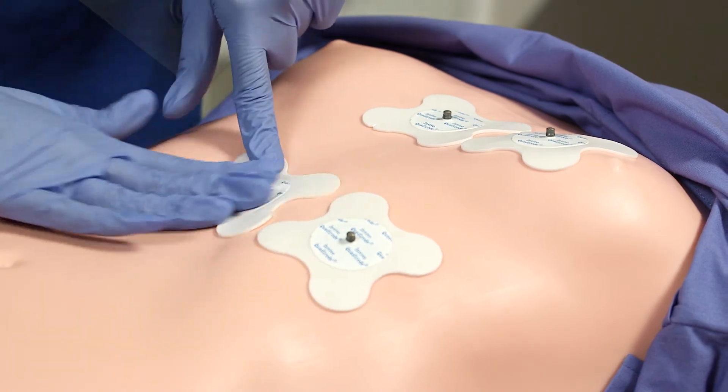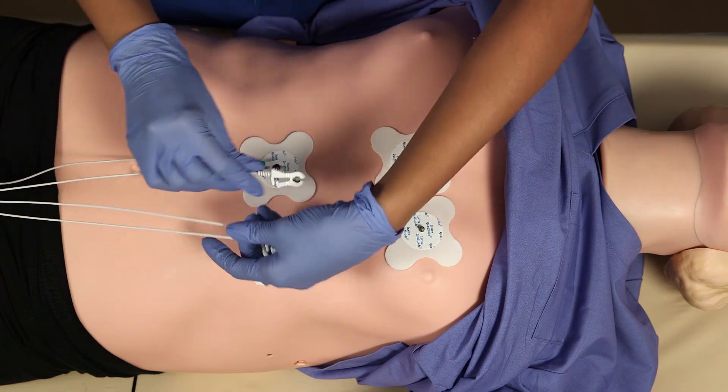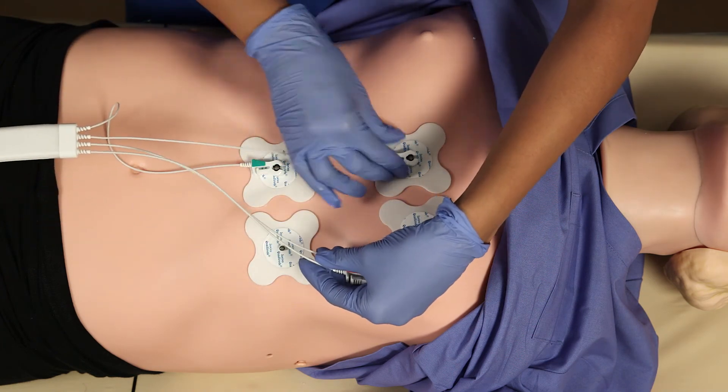If you prepped your patient correctly and placed the quatrodes but are still not getting the QRS high enough in relation to the reference line, there are a couple of things you can try.